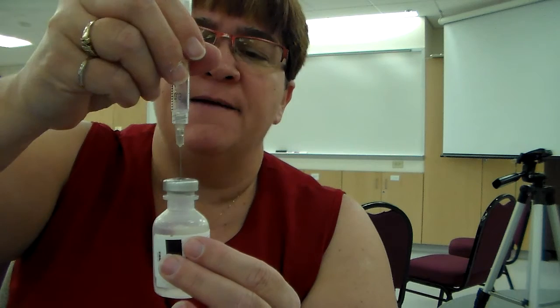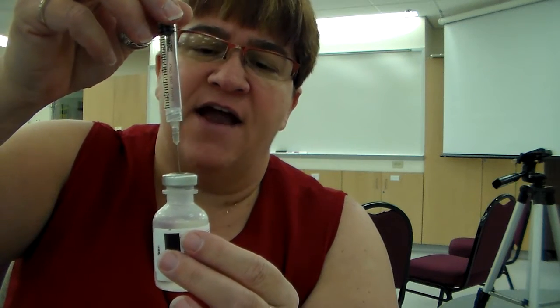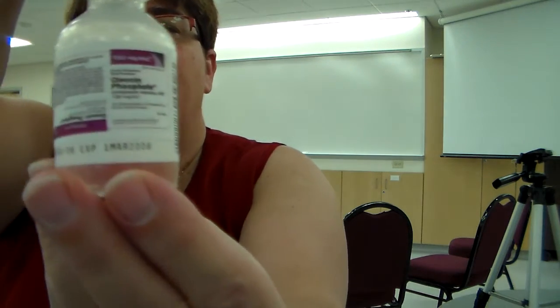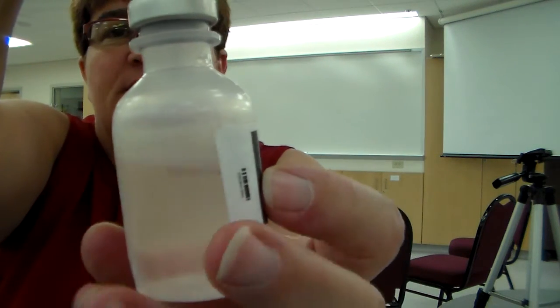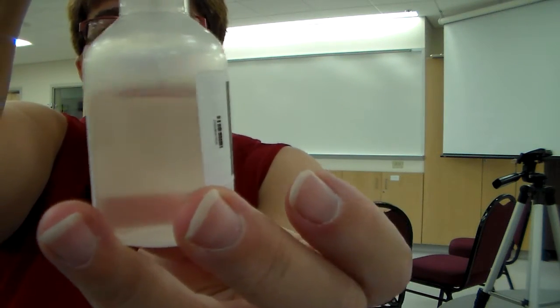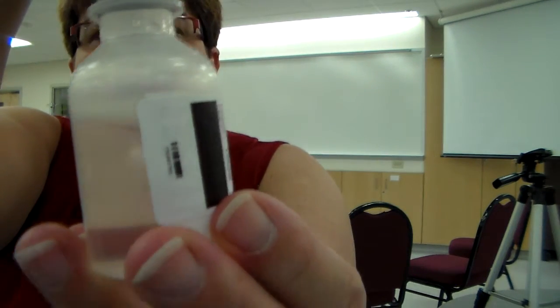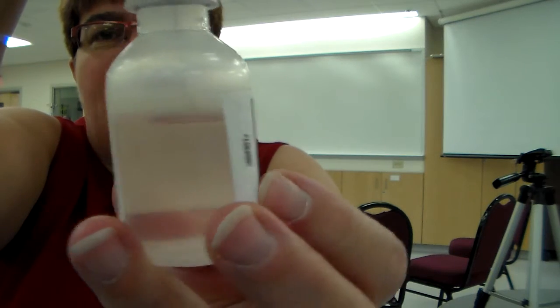What we do is we leave the vial on the counter. Okay, so on the counter, and you're going to take and put the needle into that rubber stopper on the top. Okay, and you're going to instill the air without putting the needle into the liquid in the bottle. Whoops, see if I can turn this. We don't want to do this. We don't want, when we're putting it in, to get air in there. Did you see that air go in there?